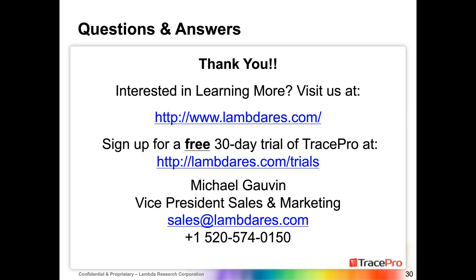Okay, a couple of questions here that I would ask too. Does TracePro have a human tissue catalog? Yes, we have a human tissue catalog. It's based on Valery Tuchin's work. He's one of the best known people out there in the industry for taking samples and going through and creating. We use the Henyey-Greenstein function, and he supplies a complete definition of human tissue and for the different layers inside of the skin. And we've been using him and following his capabilities and his papers for the last 10 years. And a lot of that information is in our human tissue catalog.